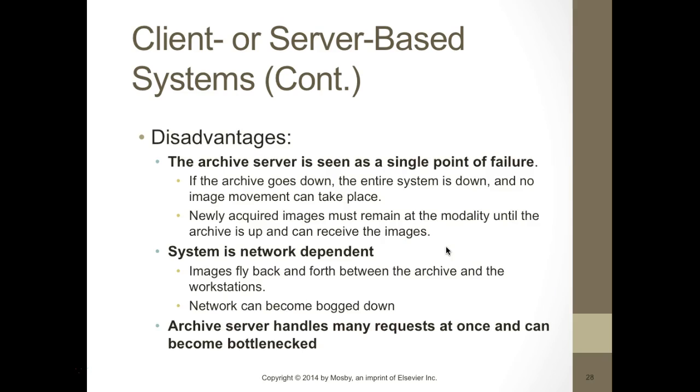So the disadvantages of the client or server-based systems is the archive server is seen as a single point of failure. If the archive goes down, the entire system goes down, and no image movement can take place. So newly acquired images must remain on the modality until the archive is back up and can receive images again. So it creates a huge backlog.